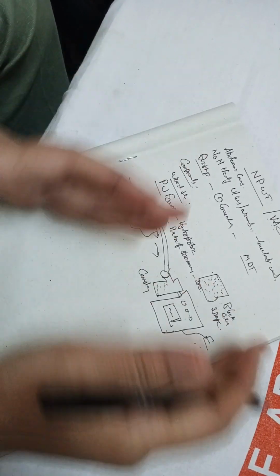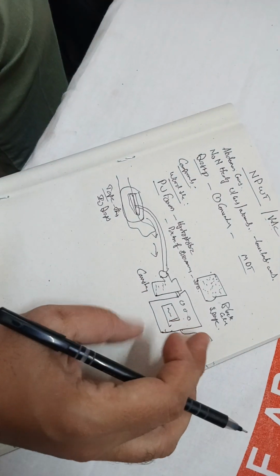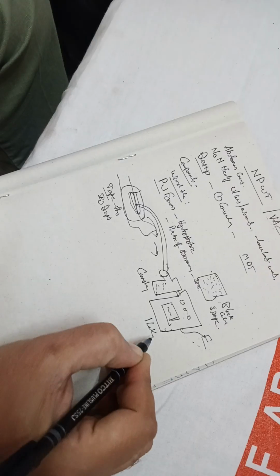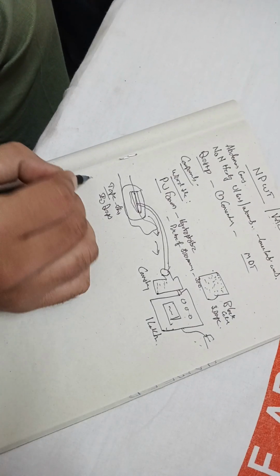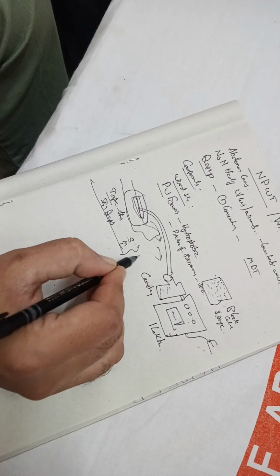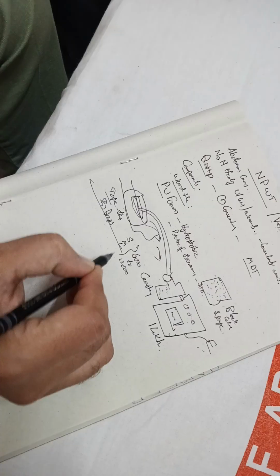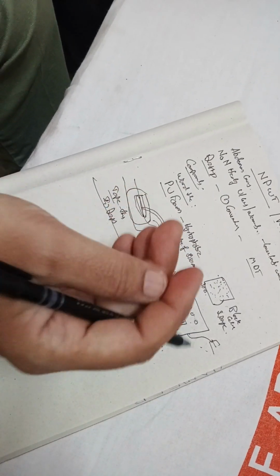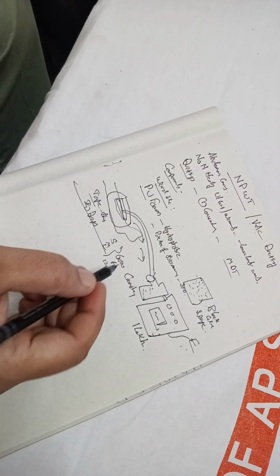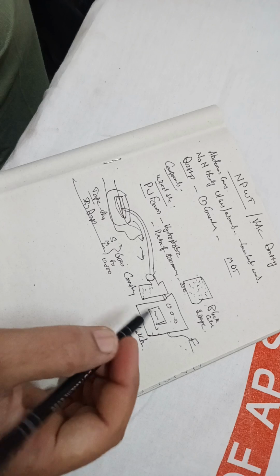Initially these were very large and very bulky, but now very small ones are also coming, and this is a little bit costly also. Minimum cost is 1 lakh. And there are consumables. This will come in small, medium and large size, and the cost will range from 6,000 to 12,000 per sitting. So that is why it is a little bit not popular in government setup. But we can do the cost cutting, that I will tell you later. Those are all practical things.